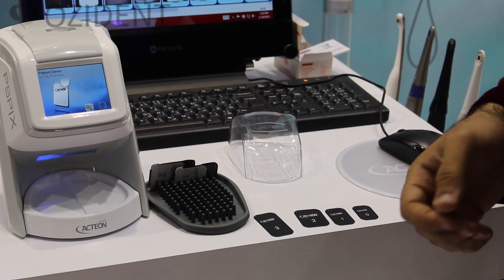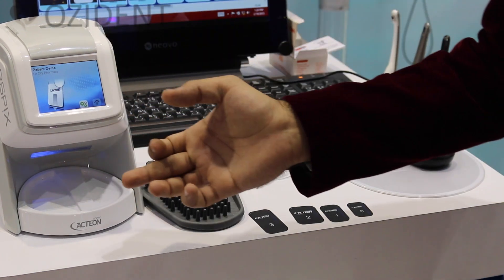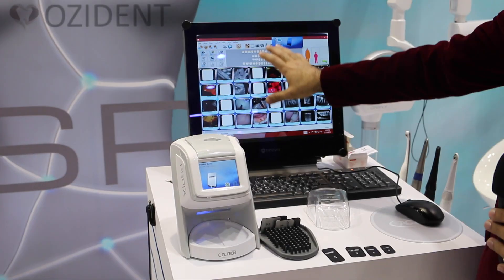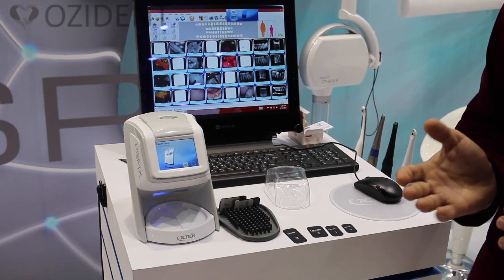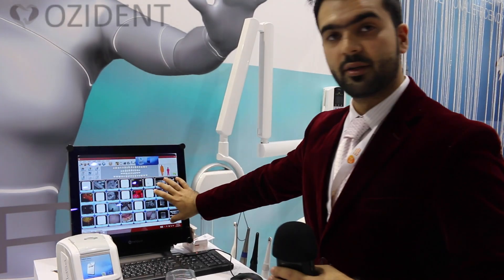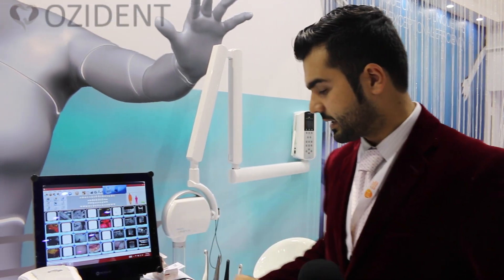After the exposure is done, you put it in the machine — it does the scanning — and the special software designed for this machine will automatically recognize the images and merge them together in the best way possible, then you have the image. The software is very powerful and you can do lots of editing, which I'll show you in a moment.